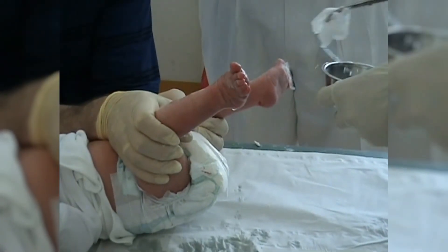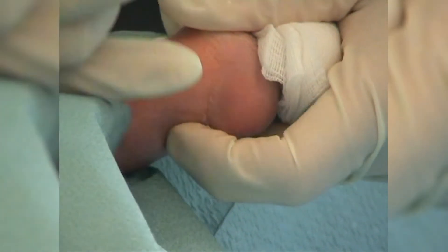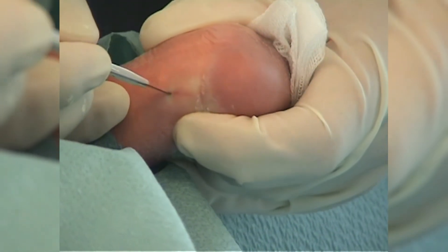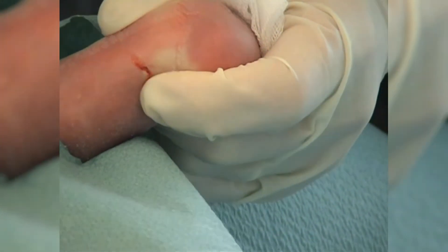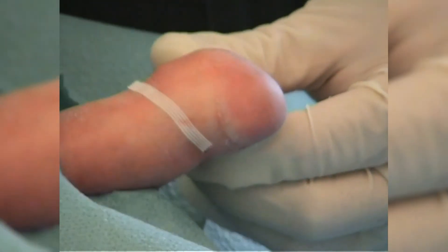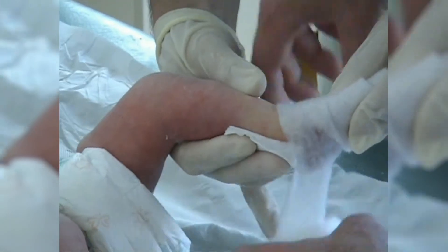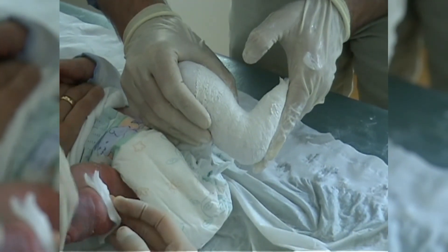The plaster is left for 15 minutes, then the area is disinfected and the percutaneous tenotomy of the Achilles tendon is performed. A number 11 scalpel is inserted medially from the palpable tendon, then passed under the tendon and a complete tenotomy is performed. The tiny incision site can easily be closed with two sterile strips. The last plaster cast is then applied in the maximum corrected position, usually where abduction reaches 60 to 70 degrees and dorsal extension of the foot reaches about 20 degrees.